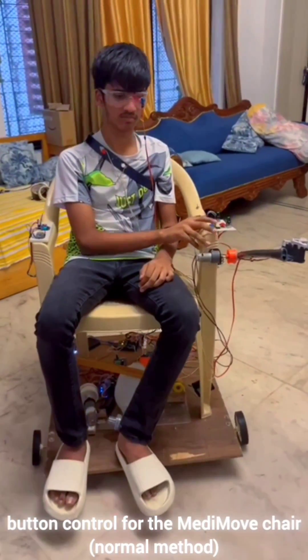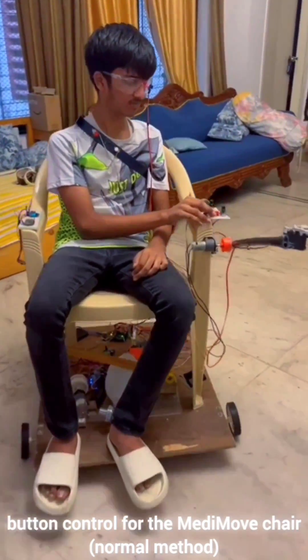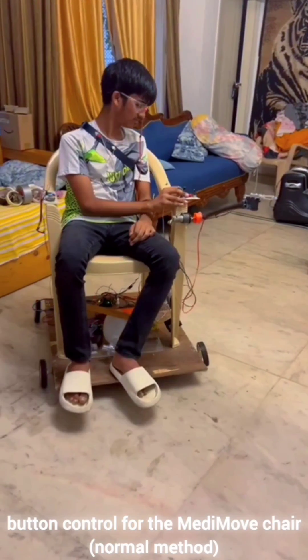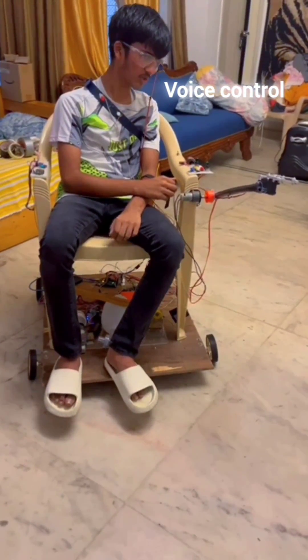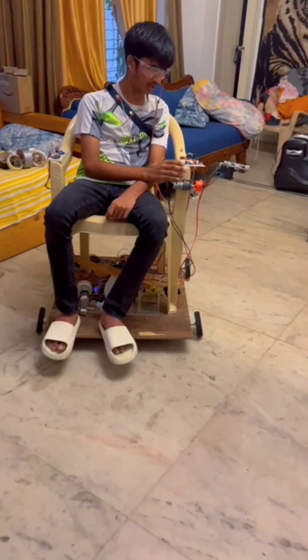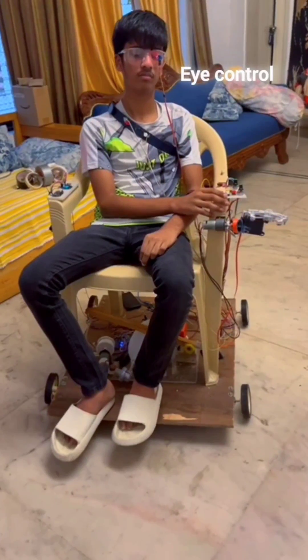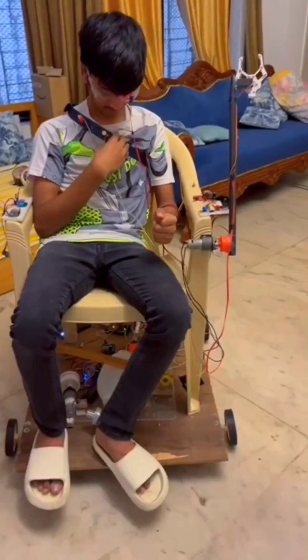These are the methods of controlling the smart motorized wheelchair. One method is the normal method of controlling through the button panel on the chair itself, but not everyone can do this because some may not have an arm or working arm. For that, there is voice control — go right, go forward, go back. There is also eye movement control, and features like gesture control can be added easily.